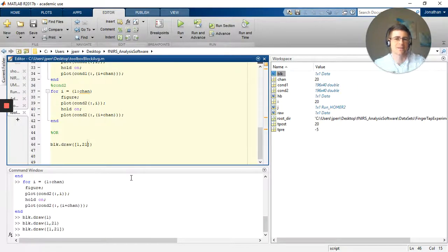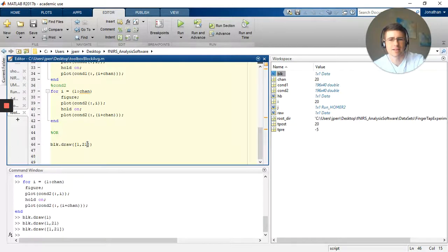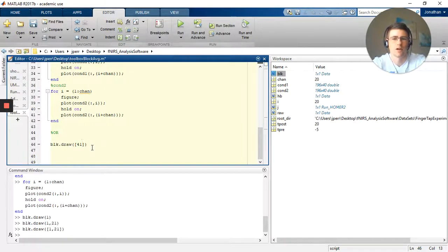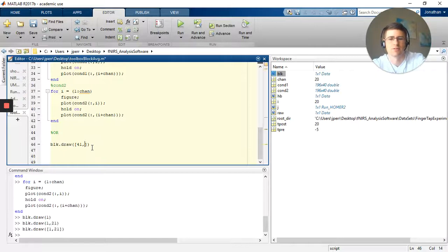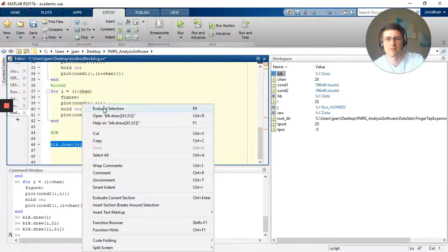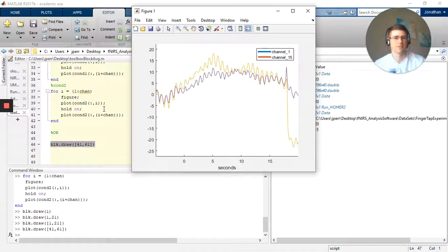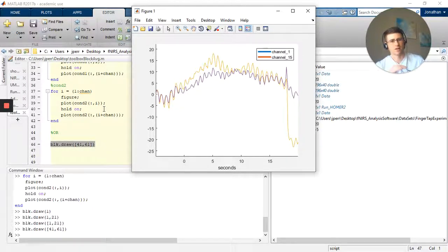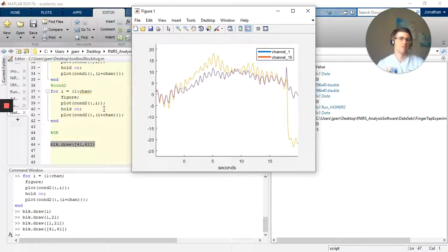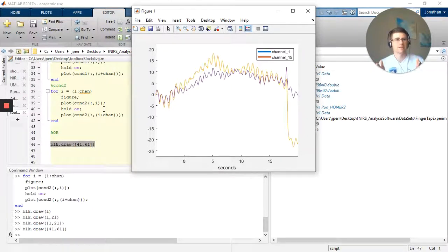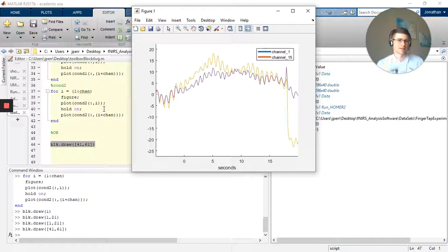But what's pretty neat is, well I can actually do channel 41 and channel, would it be 61? Let's see if that works. Here we go, there it is. So now the third dimension is in a way concatenated onto those 40 channels.